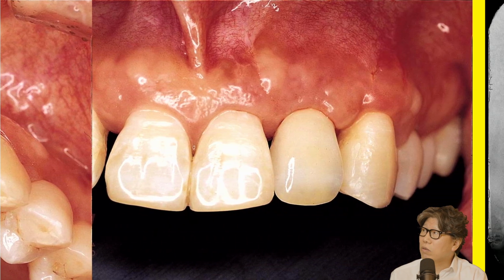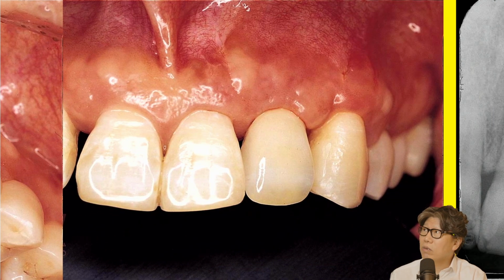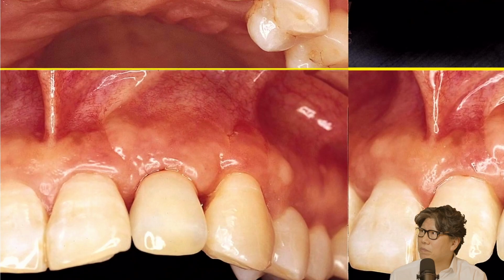And this is a lateral incisor. Same thing here. It's aesthetic. It's got a good emergence profile. It's got a good implant.